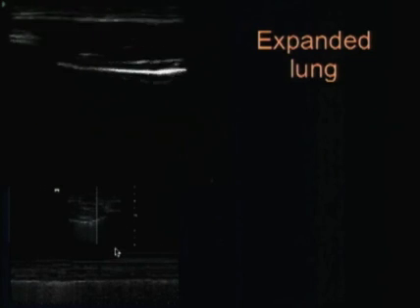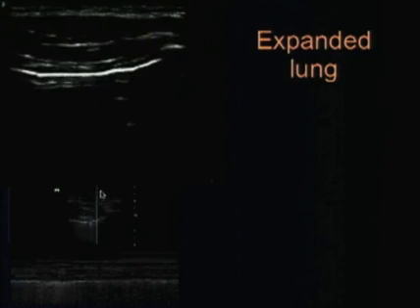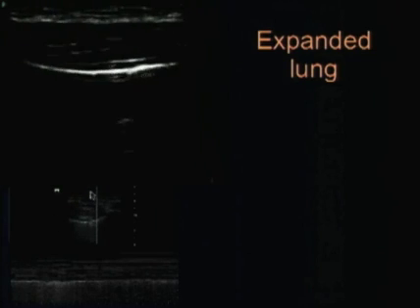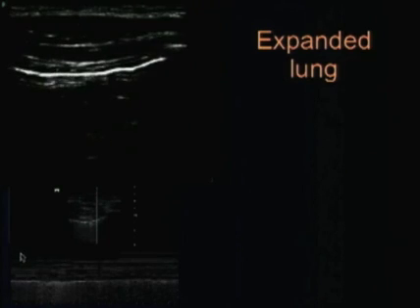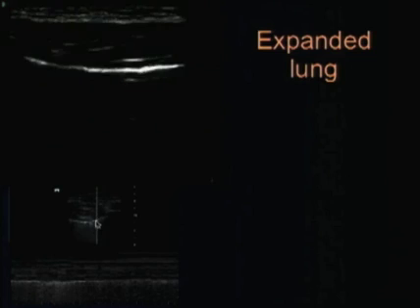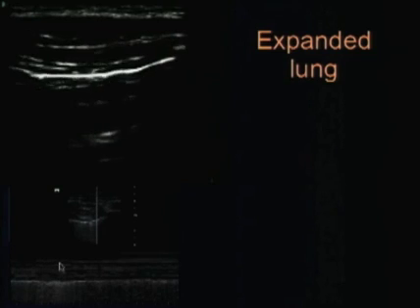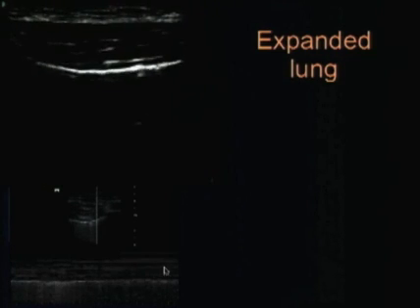Down here we have an M-mode rendition of this image. And what happens when you put M-mode down through this rib space here is that the tissues from the skin down to the pleural line are essentially linear, because there's continuity of those echogenic interfaces that's continuous through time, so that you get a pretty much continuous, fairly linear looking pattern here.